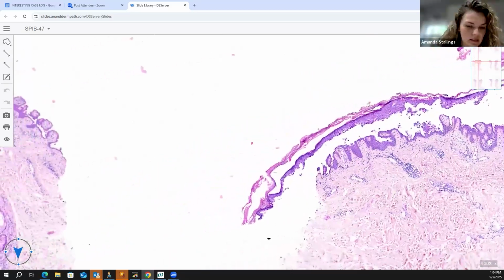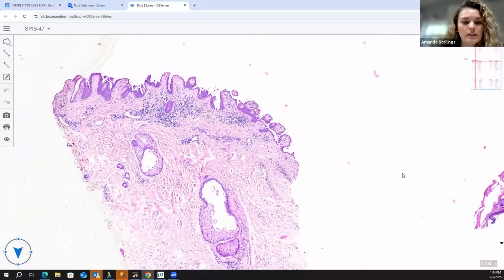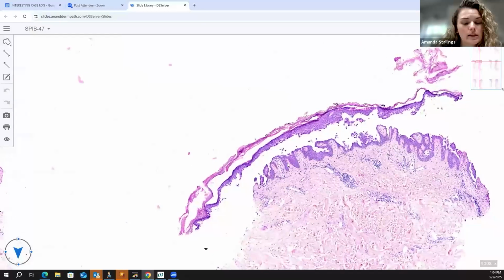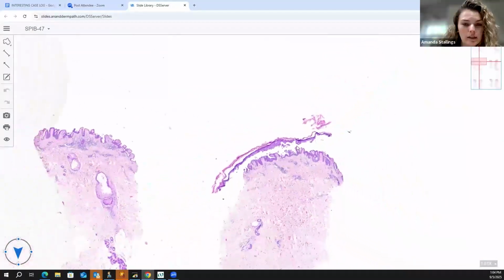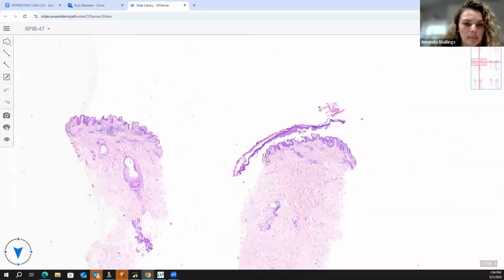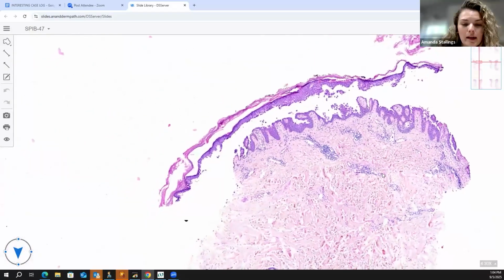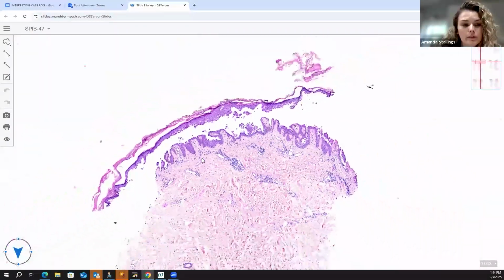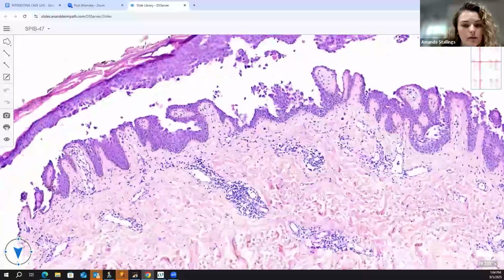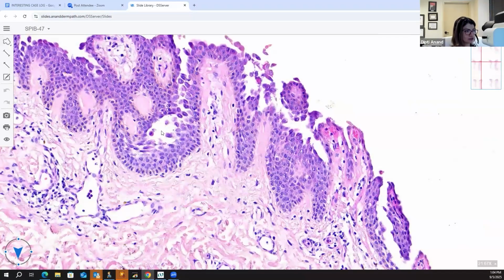This one looks like an intraepidermal blister, and we can see the split was kind of suprabasilar. And there's some of that tombstoning, so it looks like pemphigus vulgaris. Why is it not Hailey-Hailey? That would have more complete acantholysis with the dilapidated brick wall, and pemphigus vulgaris can involve the hair follicle more so. This to me looks like a dilapidated brick wall.